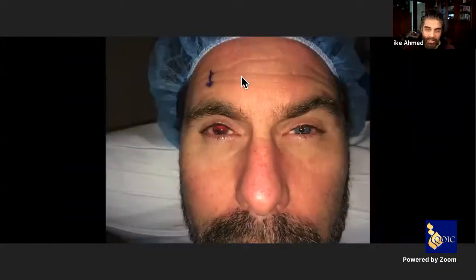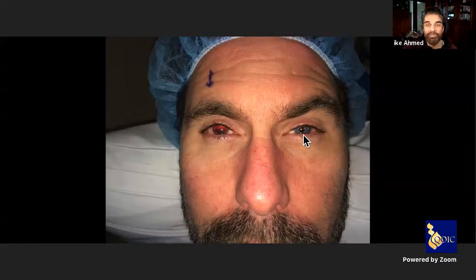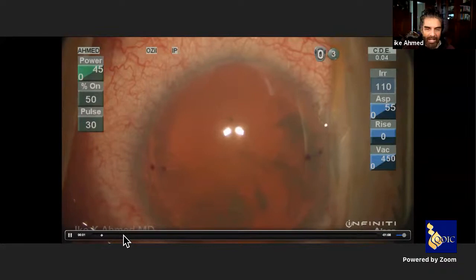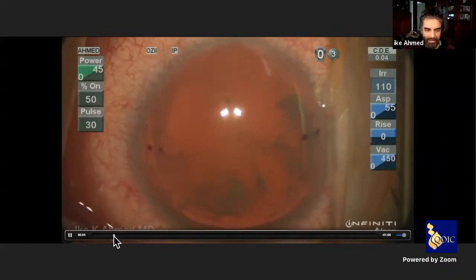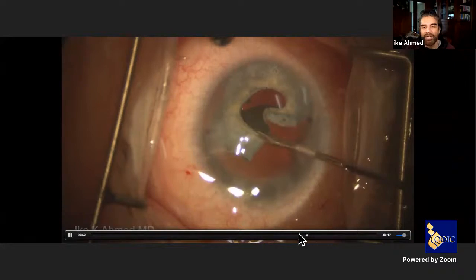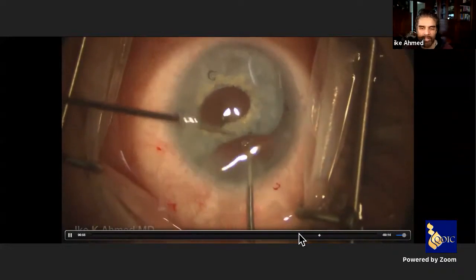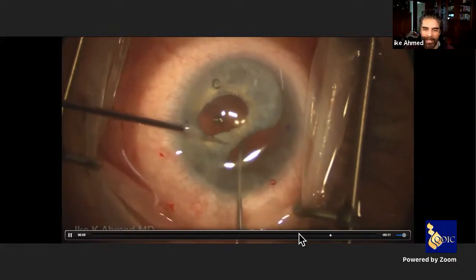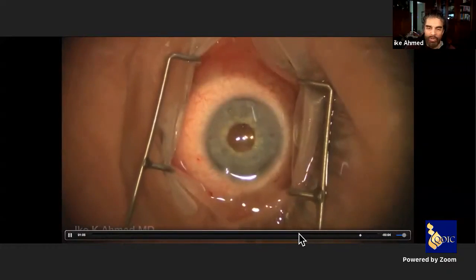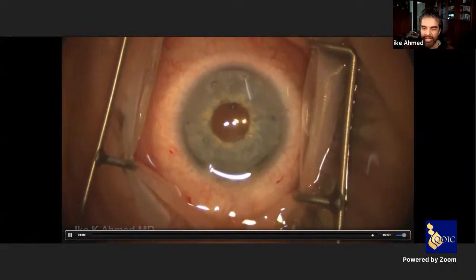This patient has congenital aniridia and cataract. I had already done the left eye, and we are performing the right eye. I told the patient they could pick any iris color from a magazine — and that is what we did. In this case it involved a toric lens for associated cataract and aniridia. We placed the lens in the capsular bag and then placed the prosthesis into the capsular bag as well. We typically use a 9–10 mm implant in the capsular bag, slightly larger if in the sulcus. The cosmetic result is quite nice.